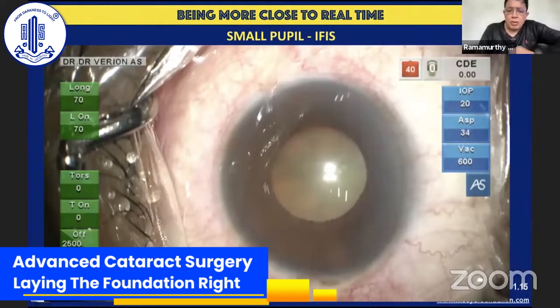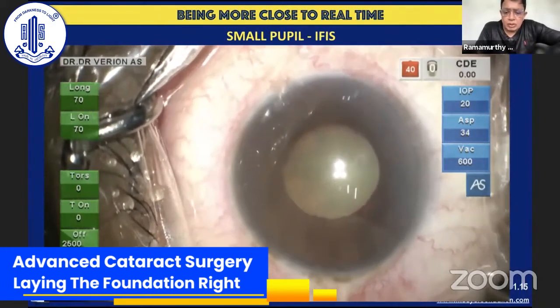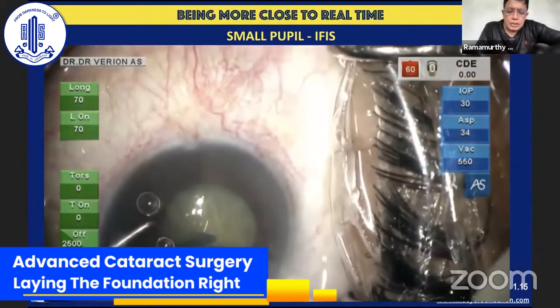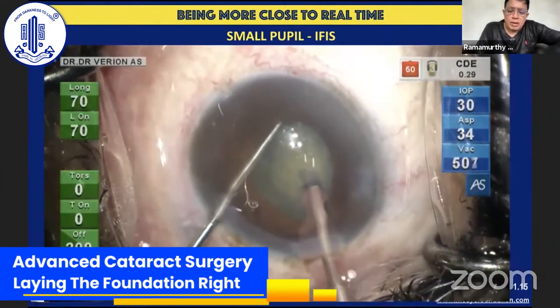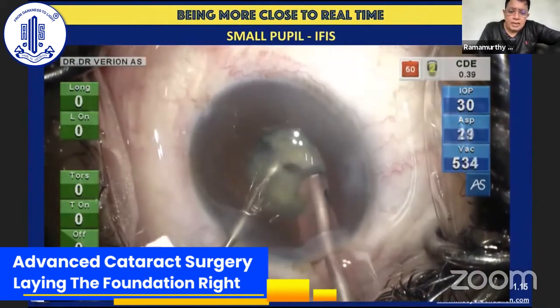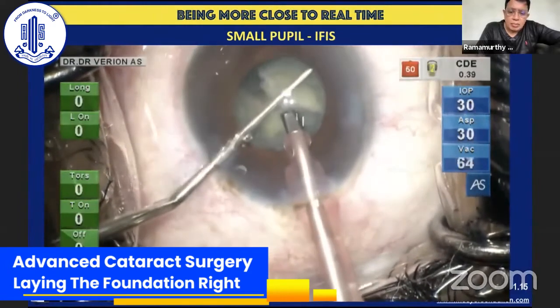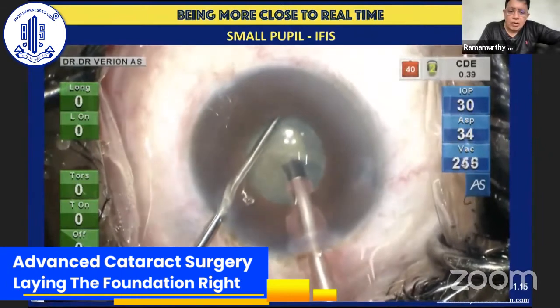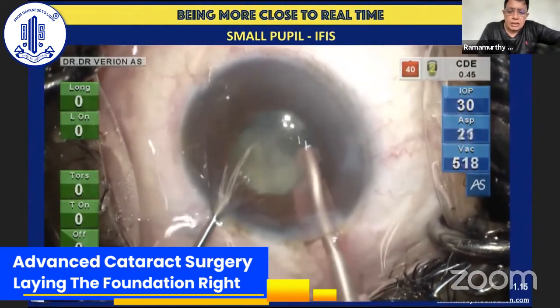What about a small pupil situation like this? Dr. Vasavda also showed a nice case where he treated a small pupil situation. For me, there is a difference between a small pupil and a small rhexis phacoemulsification. Whenever I have a 3.4 millimeter pupil, I'm able to run the rhexis beyond the limits of the pupil and have a 4.5 millimeter rhexis. I often do not resort to any pupil expanding devices, whether hooks or other expanders.